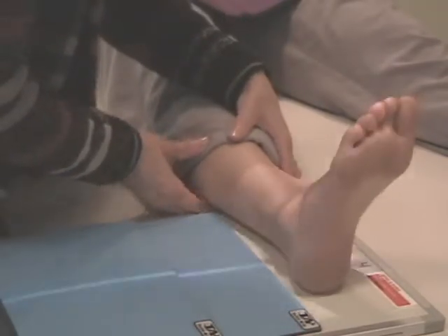And if you can see the ID blocker here, there is a little bit of shadow over the ID blocker. Okay? What the shadow is over the ID blocker is her first digit here. That is not a part of the ankle joint. So having shadow over the ID blocker is acceptable because, again, it's not the ankle joint. It's this portion of her foot here.